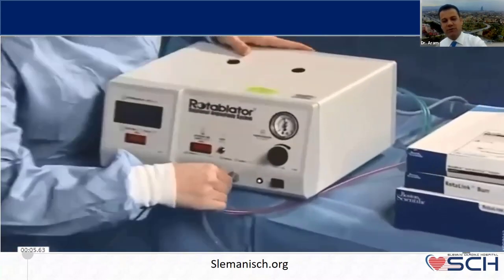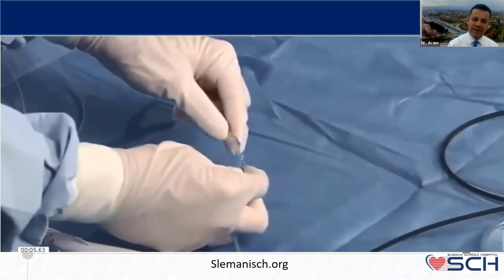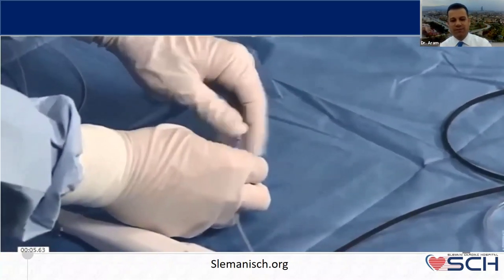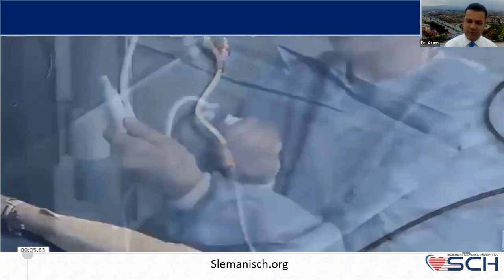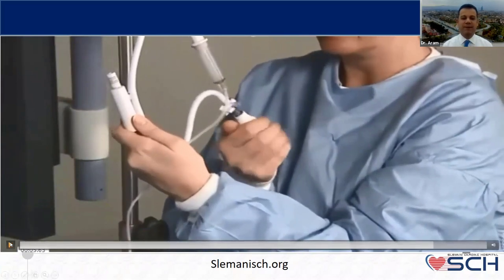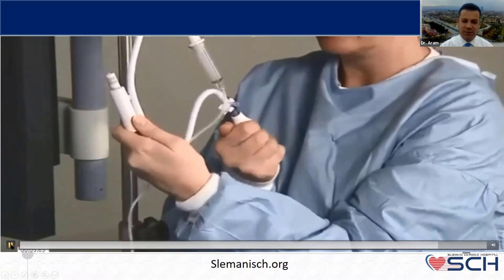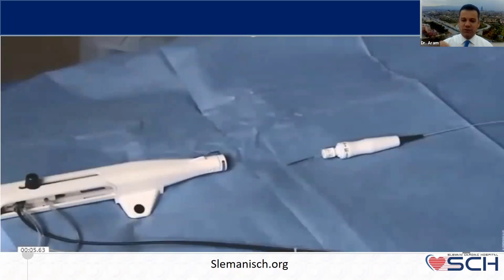This will be attached to the console, and from the console to the gas tank, because it will bring the gas there. And this is for the saline infusion, because the saline should be available all the time throughout the procedure, and we should pressurize the saline. We should make a pressure of up to 200 millimeters of mercury, because this device is going to rotate about 180,000 rotations per minute.